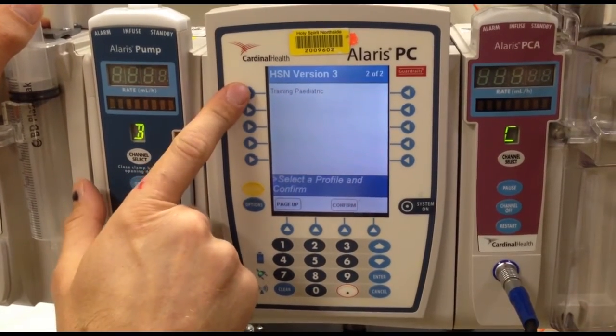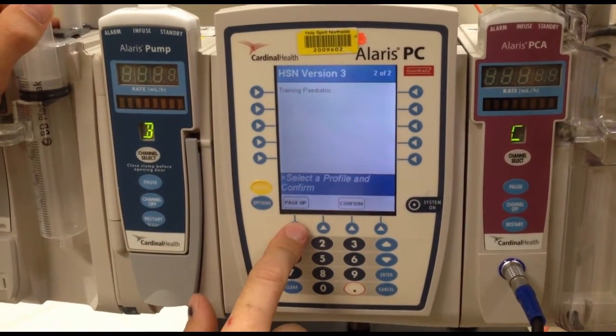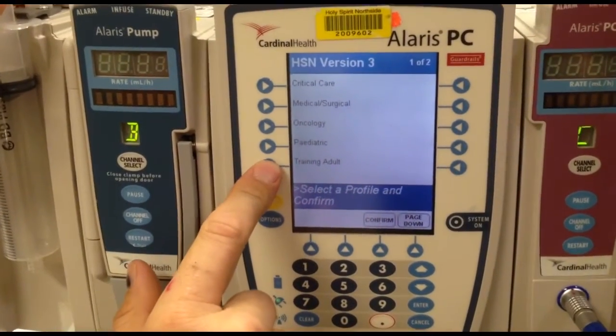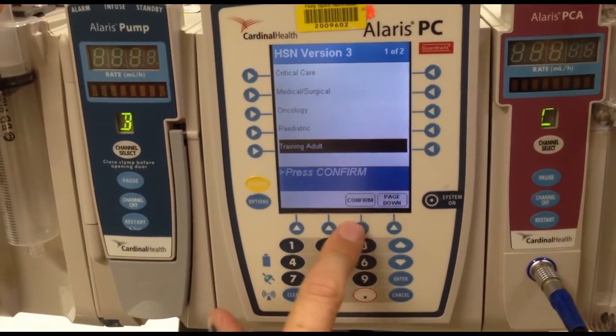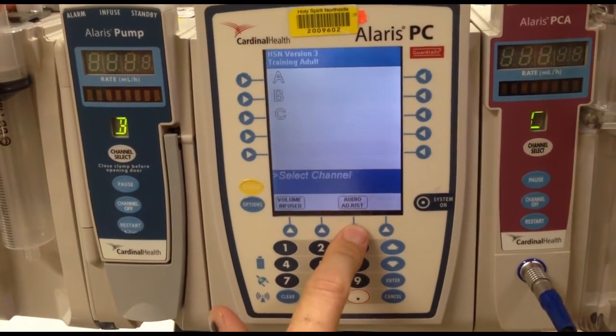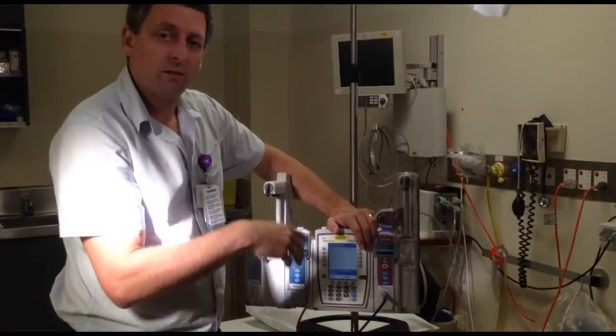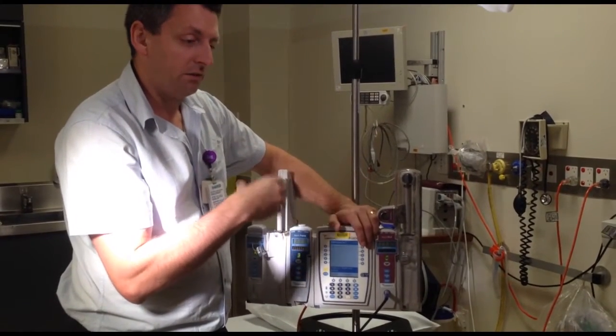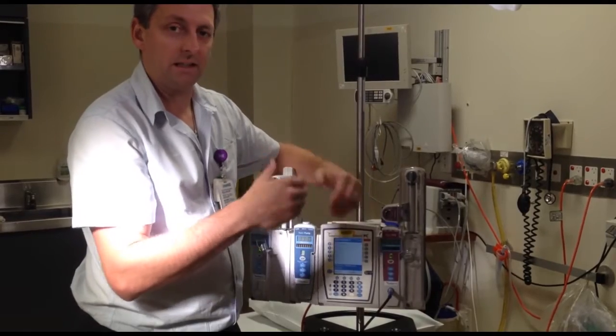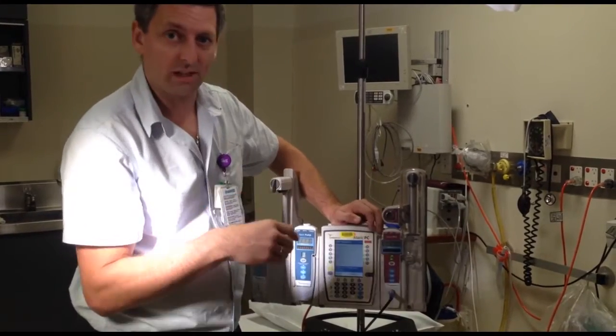So we have critical care, med surge, oncology, paediatric, adult training, and if I page down, I have paediatric training too. They're good if you're teaching anyone new to use these pumps — do it in training mode, because the data collected in here is used for working out incidences and errors, which we'll discuss later.